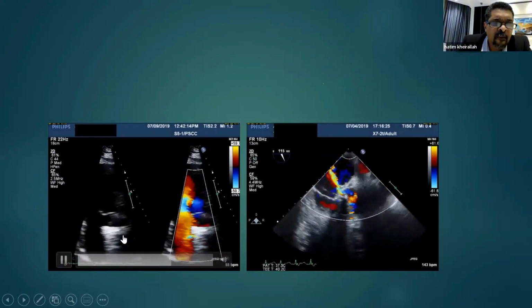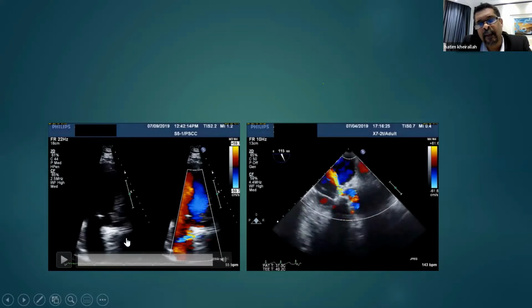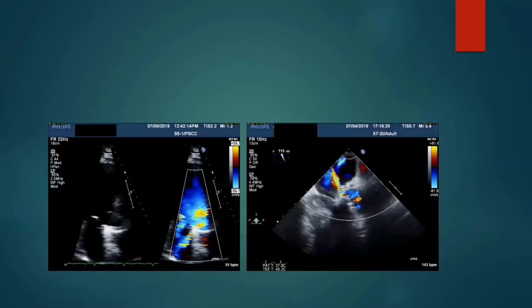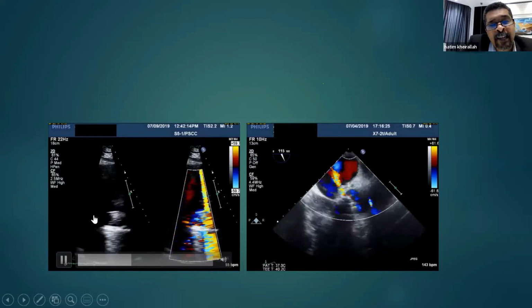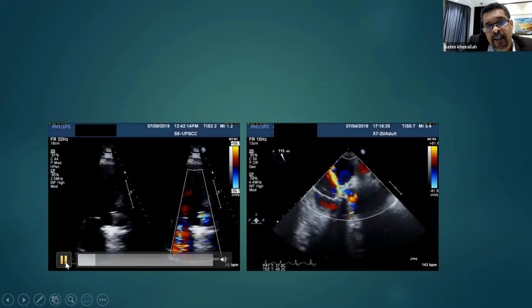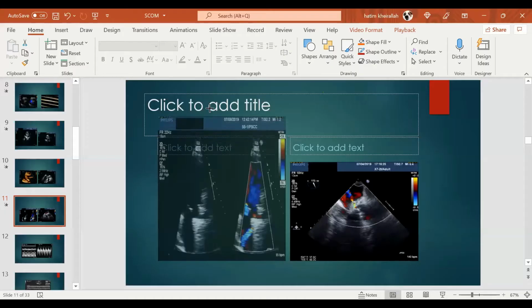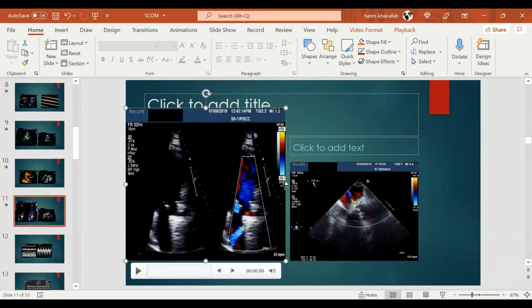This patient is just 4-5 days post metallic AVR. After AVR, is it the rupture of the anterior mitral leaflet, perforated? Now look at the anterior leaflet. The anterior leaflet is here, down here, but the flow is coming above the leaflet and above the aortic valve itself. It's above the aortic valve. Septum. I'll show you. Sorry, septum.